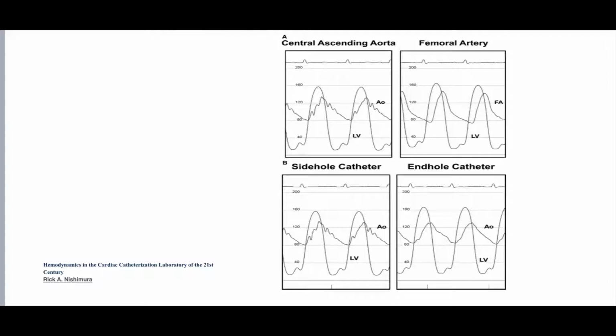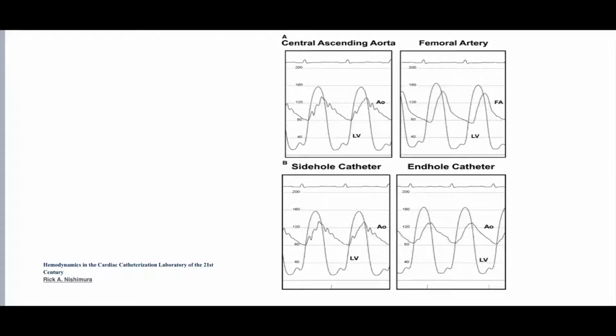Because the blood is going away from the valve area. Should be calculated... Okay, you are so close. The gradient should be near the area of stenosis. So whenever you go away, it gives you underestimation. Yes. And why is that?